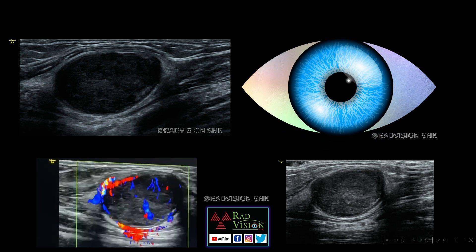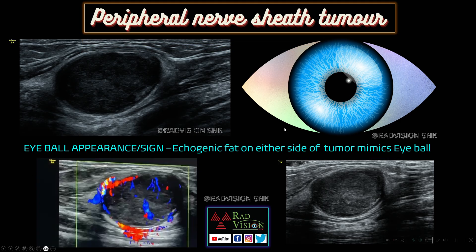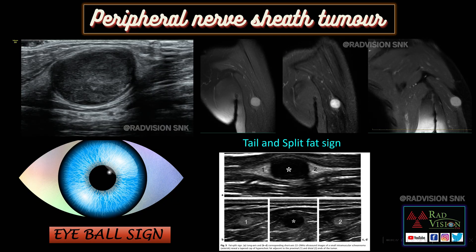The echogenic cap-like structure on either side of the lesion is the split fat sign. I have coined a new term because this echogenic cap-like structure on either side of the lesion typically mimics the sclera, with the central lesion mimicking the eyeball — so I have given the nomenclature 'eyeball sign' for peripheral nerve sheath tumors, in addition to the split fat sign and tail sign. The split fat sign is classically seen on MRI.